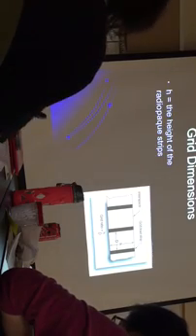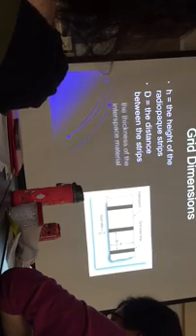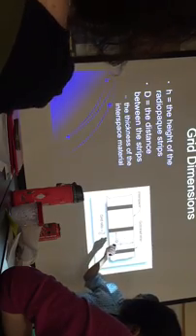All right, so let's go to grid dimensions now. H here stands for the height of the radiopaque strips. So here, this is H. D is the distance between the lead strips. It's the thickness of the interspace material. Whatever you place in here, that's D. This is going to be useful when we study grid ratios. Grid ratio is the height of the lead strip divided by the thickness of the interspace material, or the spacing between lead strips. Pretty straightforward, right? Okay, so let's take a look at grid ratio.